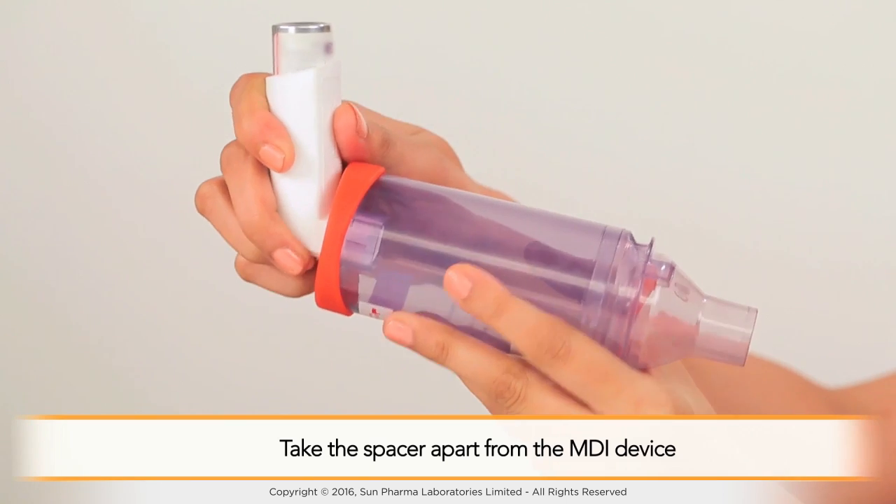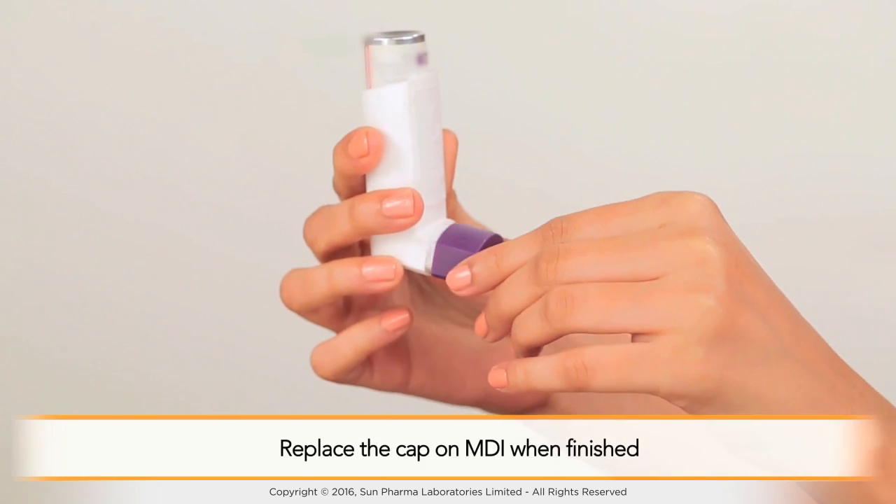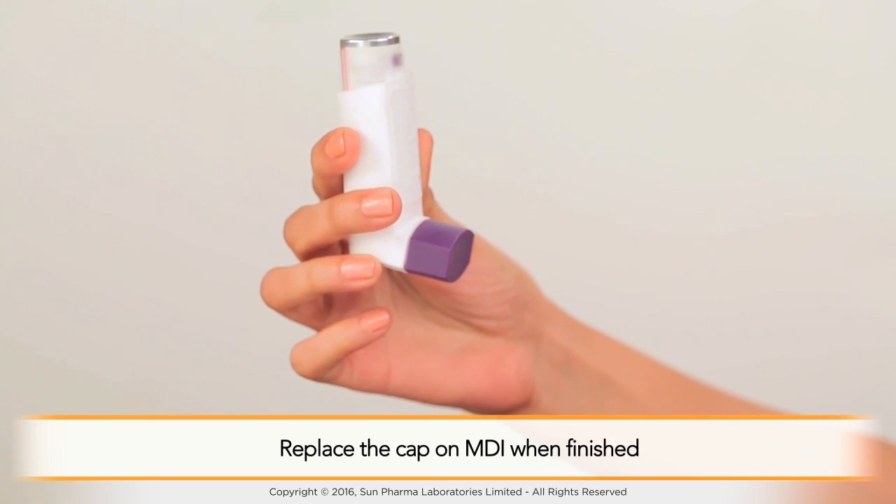Repeat the above steps for each puff as advised by your doctor. If you need a second puff, wait for about 15 to 30 seconds between puffs. Take the spacer apart from the MDI device and replace the cap on the MDI when finished.